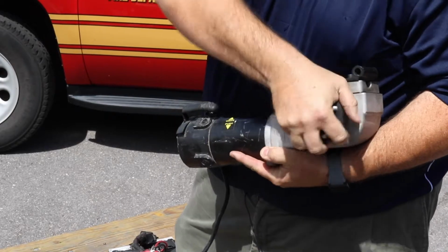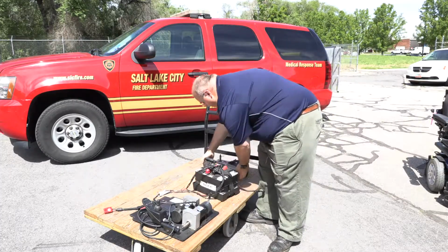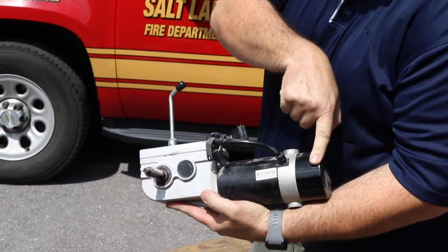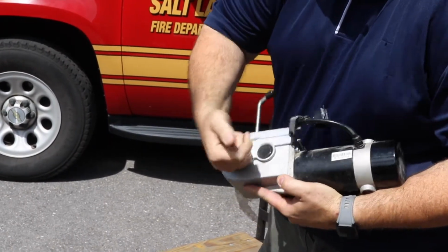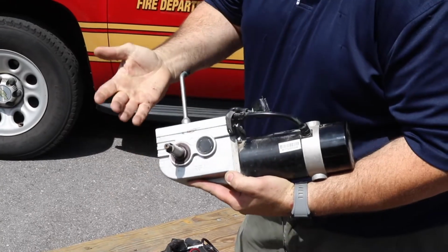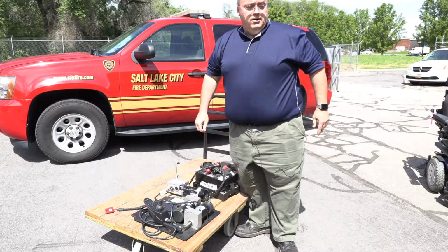To drive, okay, then that's locked, all right? This is an example of disengaging the gearbox. Brakes here, no lever on it, motor there, gearbox here, okay? That's locked. Nice, cut myself. Twist that lever, and then this is in freewheel, okay? It's important to understand that in a power wheelchair that's functional, the brakes are always on.